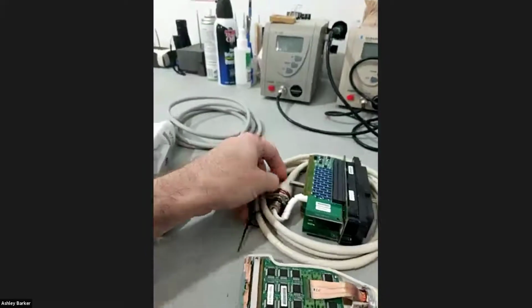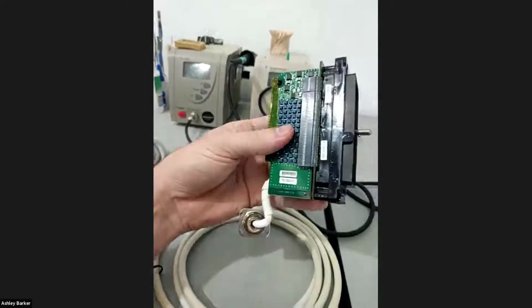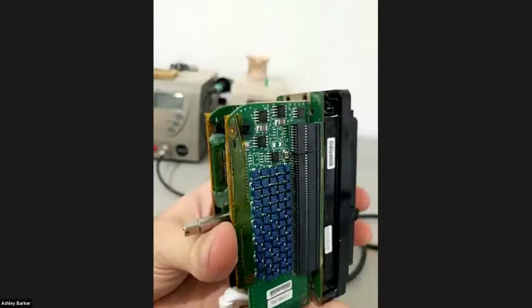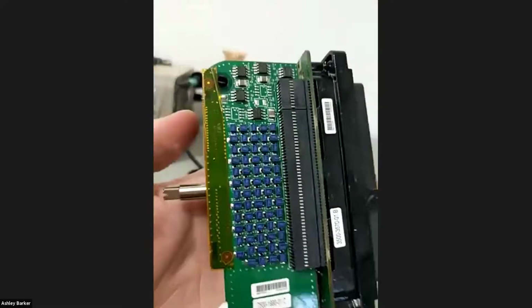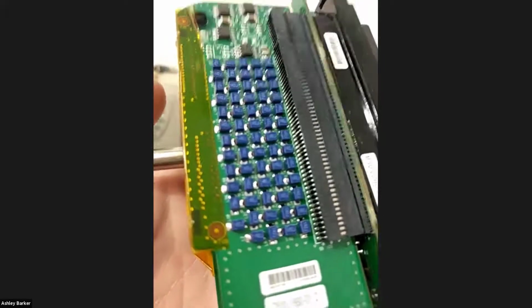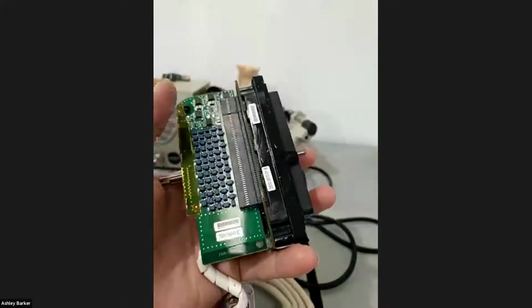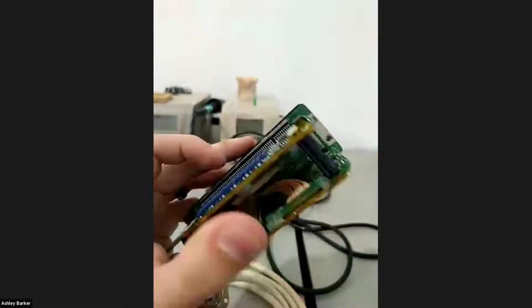Then we've obviously got the cable comes down, and I've pulled apart the connector end as well so that you can actually have a look inside there. So obviously the front part of the connector that you're very used to. And then there's some circuitry, and some probes have more complicated circuitry than others, but most probes will have lots and lots of these little inductors. You can see those little blue inductors, and their purpose is again to match impedances, this time electrical impedance, not acoustic impedance, of the cables connecting up and going up to the crystals. It's all impedance matching. And so every element has one of those attached to it.